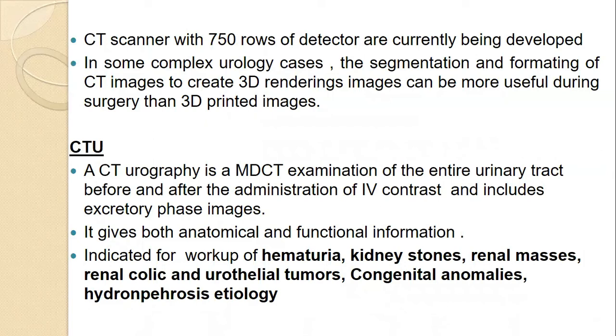CTU. A CT urogram is a multi-detector CT examination of the entire urinary tract before and after administration of IV contrast, including excretory phase images. It gives both anatomical and functional information. That's why it's the investigation of choice in urology. Indicated for workup of hematuria, kidney stones, renal masses, renal colic, urothelial tumor, congenital anomalies, and hydronephrosis.